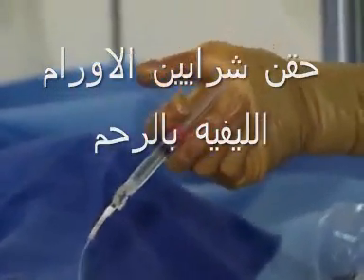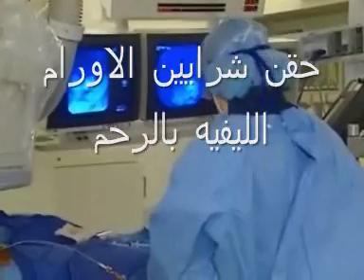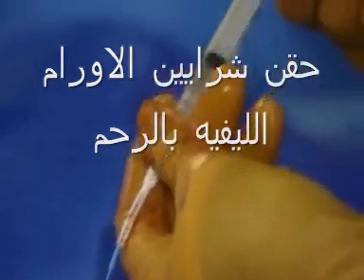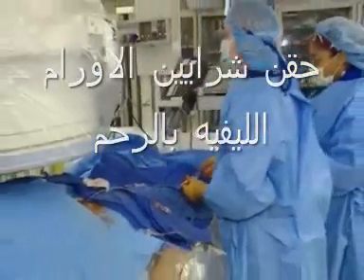Prior to injection, the microspheres are loaded into a syringe and contrast is added to make them more visible. Once the Embosphere microspheres are ready, they are injected very slowly to ensure that they are delivered to the correct blood vessels. Once the Embosphere microspheres are in place, the interventional radiologist will then insert a contrast dye into the same blood vessels to make sure that they have been completely occluded and no blood is reaching the fibroid.